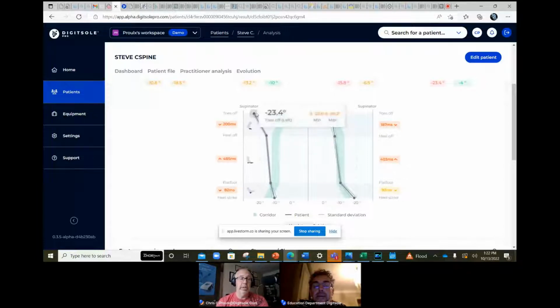He's actually continuously going into an abnormal pattern. And if you remember back when we looked at the gait line, it actually shows us that he does not transition over to the first and second toe like he does on that right side. So we look at those actual numbers and the trajectory, and we see that that is definitely going to be off. And I can visualize this too as I'm watching the patient walk.